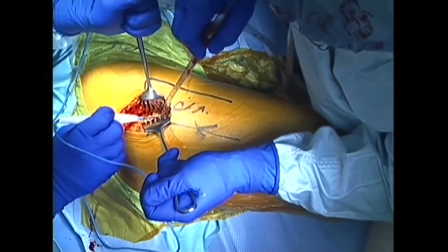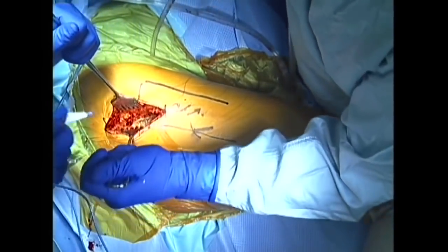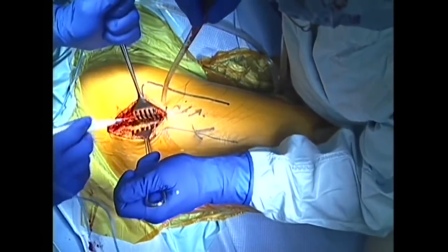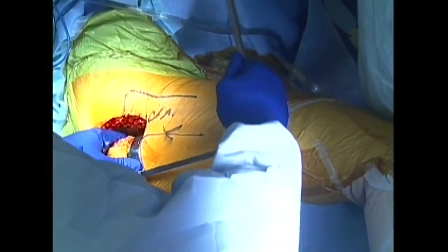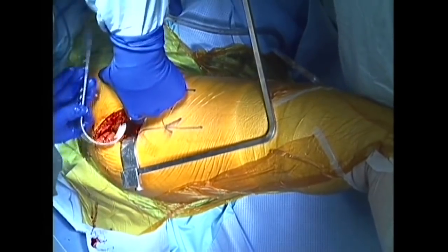An electrocautery pen is used to incise tissue and coagulate small bleeding vessels. A larger retractor protects muscles and connective tissues and assists with deeper exposure.